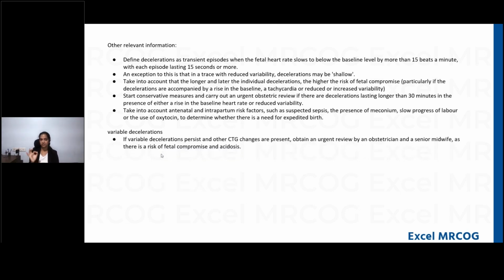If variable decelerations persist and other CTG changes are present, obtain an urgent review. So if variable decelerations, that's what I mentioned. If it is still looking normal, but there are other associated changes, you will still obtain a review from the obstetrician and senior midwife.